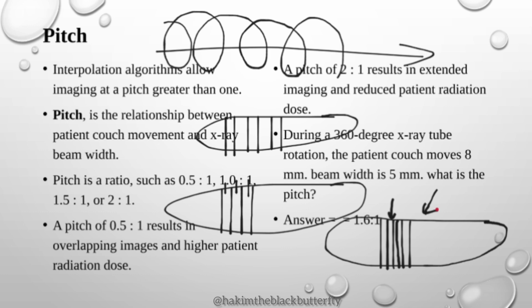because inside the head, the brain, and also some other small parts in the bones, the anatomy is limited. We have some small parts within the head that need a lot of spatial resolution for them to be visualized very well.